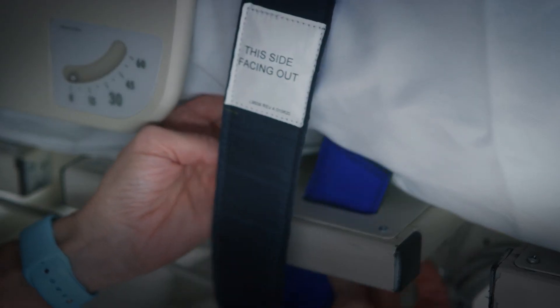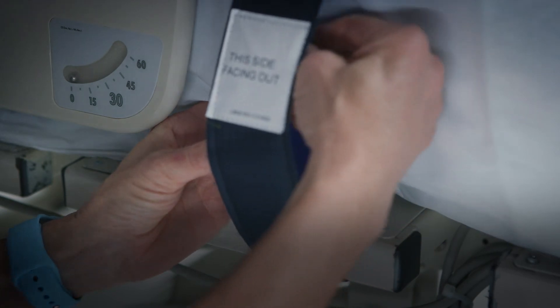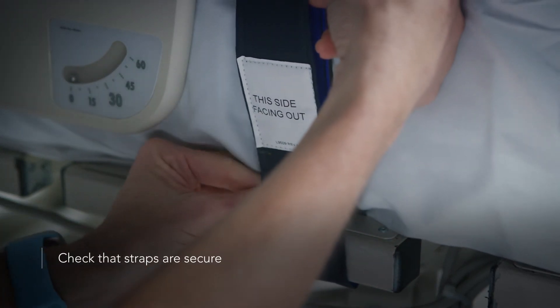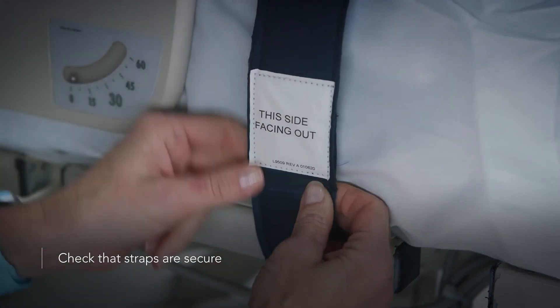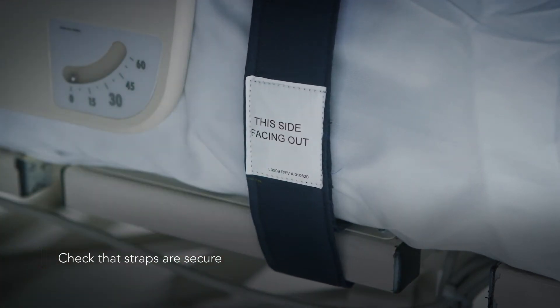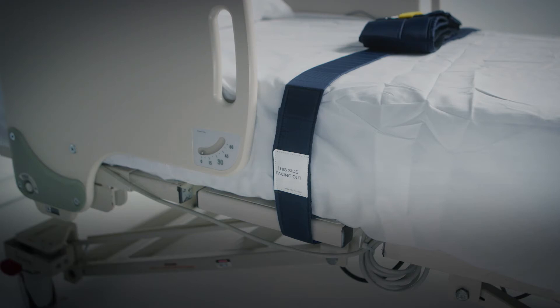At least three inches of velcro should be engaged for proper securement. Check that the straps are secure and will not change position, loosen, or tighten if the patient pulls on them or if the bed is adjusted. The straps should be snug on the mattress or frame with no slack in the strap.